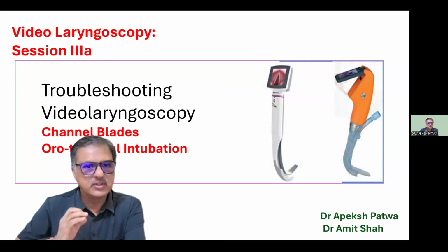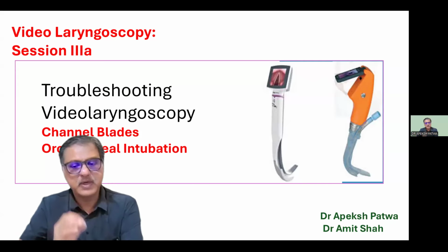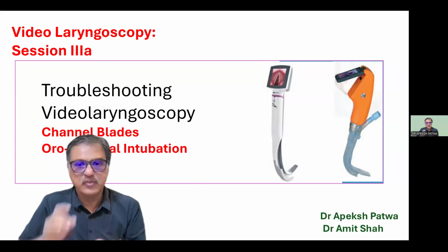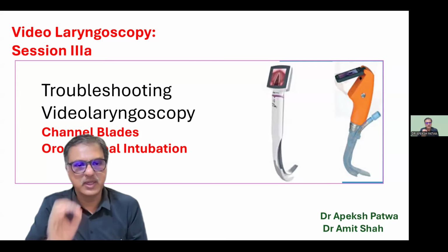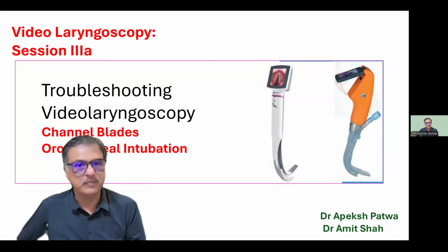Greetings. Today's video is on troubleshooting with channel videolaryngoscopy. In spite of having a good view, if you are not able to negotiate the tube into the larynx with the channel blade, this video is for you.